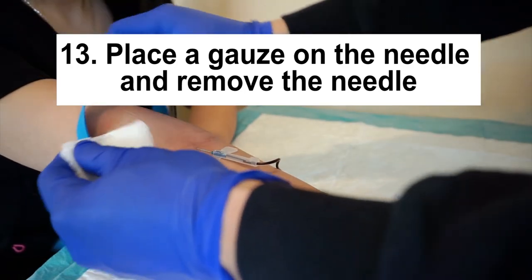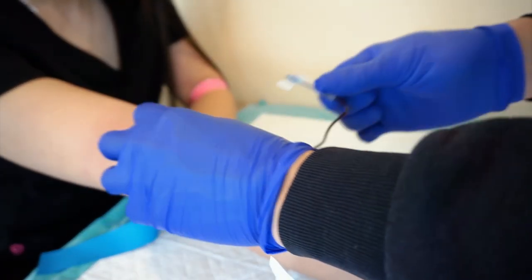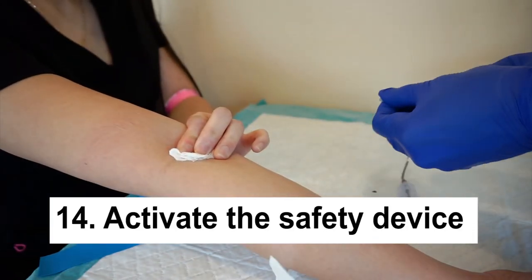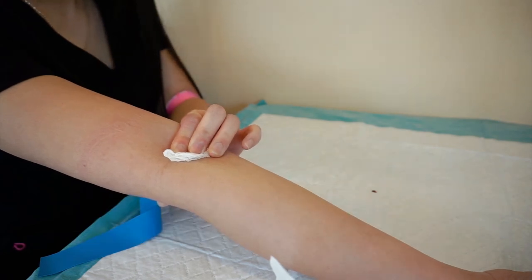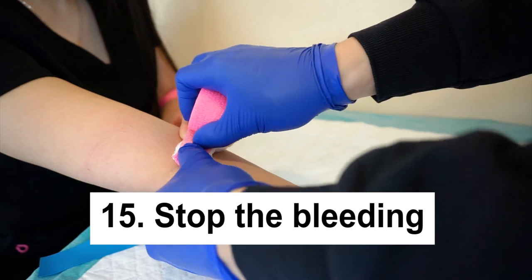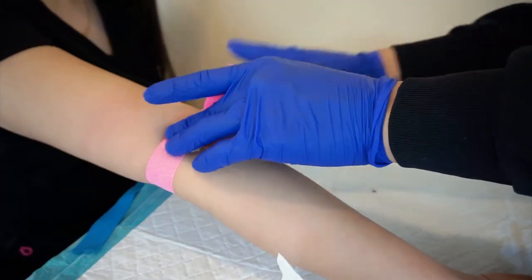I usually ask the patient to hold the gauze because that will reduce my risk of finger prick as I remove the needle from the patient's arm. Fourteen. Once the needle is out of the patient's arm, activate the safety device immediately and throw the needle away in a sharps container. Fifteen. Put a bandage on the patient, then ask the patient to keep the pressure on the site for about 10 minutes.